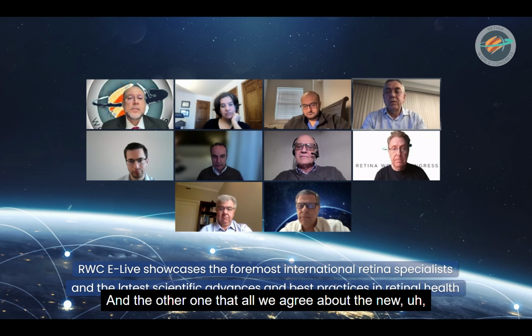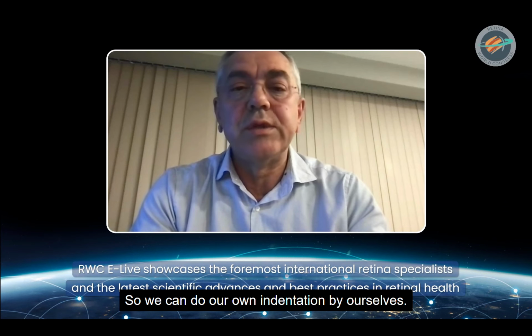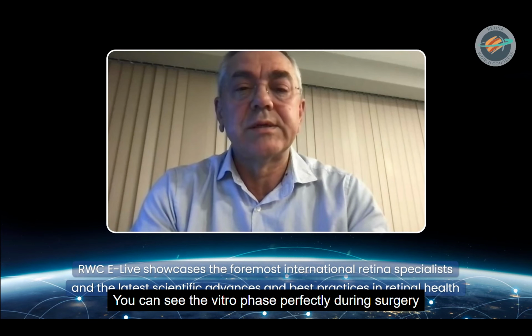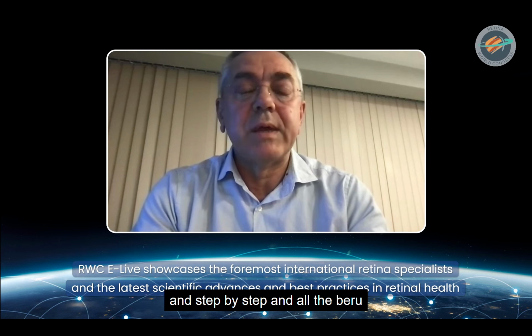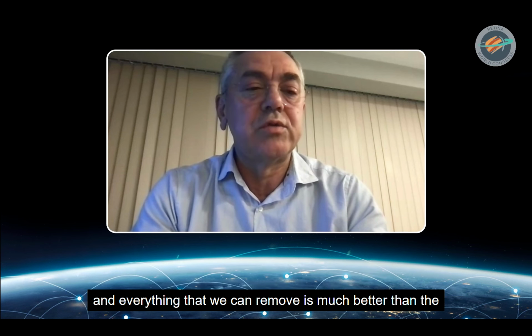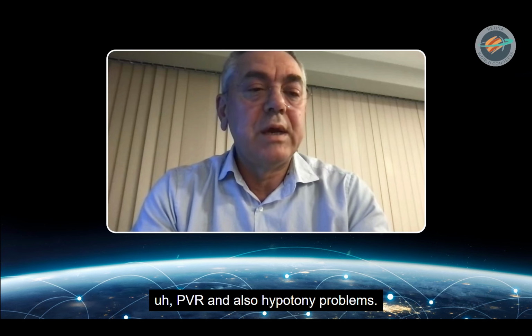And the other thing that we all agree about is the new development, especially of the visualization. So we can do our own indentation by ourselves. You can see the vitreous space perfectly during surgery, step by step, and all the vitreous and everything that we can remove is much better than with assistant indentation, and therefore technology helps us to reduce the rate of PVR and also hypotony problems. I agree.